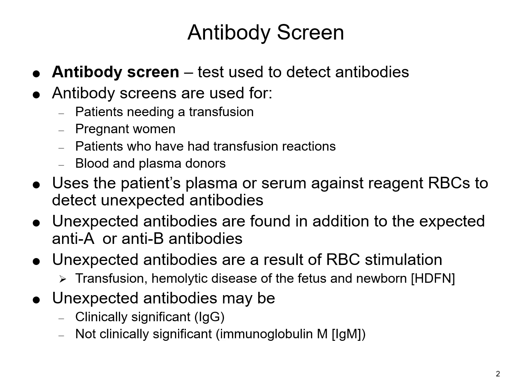But when we're testing within blood bank and we're taking that plasma or that serum, again, that's where your antibodies are present. We're testing it against known reagent red cells to see if there's any sort of agglutination or reaction that takes place. And what we're looking for is those unexpected antibodies. So usually we have those anti-A and anti-B present within our patients, but we're looking to see if there's any additional antibodies beyond those normal blood type antibody reactions.